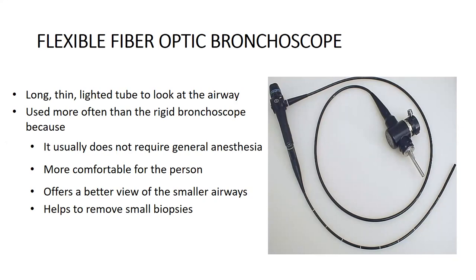Let's look at fiber optic bronchoscopy, which is a long, thin, lighted tube to look at the airways. The flexible fiber optic bronchoscope is used nowadays more than the rigid bronchoscope because it does not require general anesthesia, the patient is more comfortable, it offers a better view of smaller airways, and it helps to take smaller biopsies during the procedure.